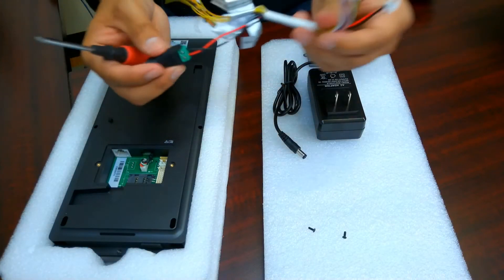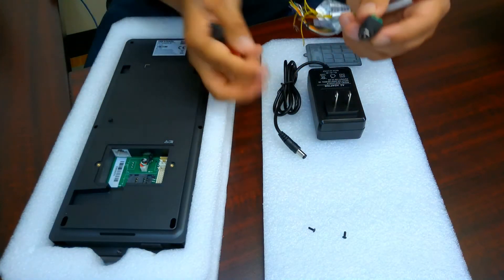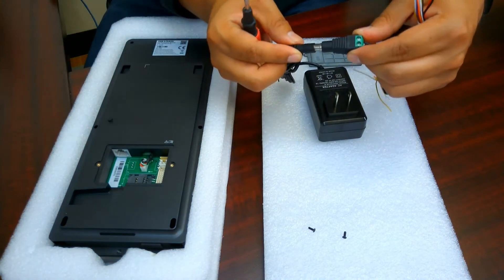So that harness is ready, connected to the power supply connector, which we'll just plug right there.